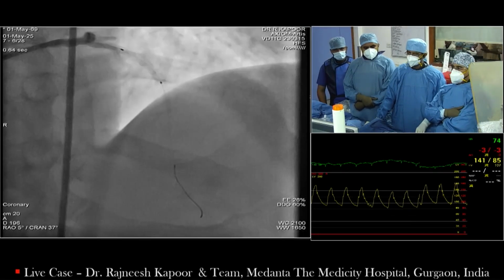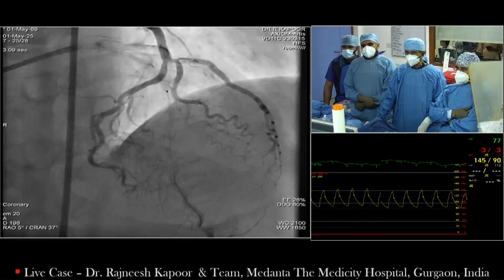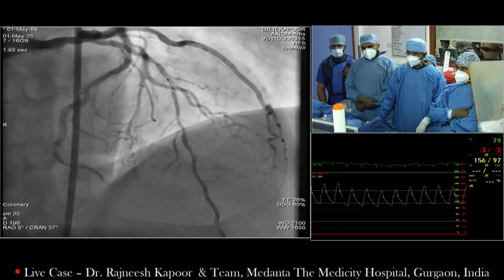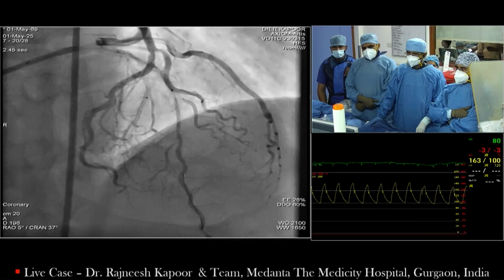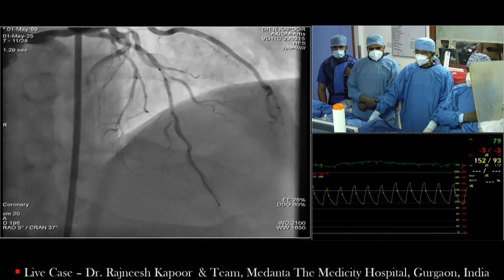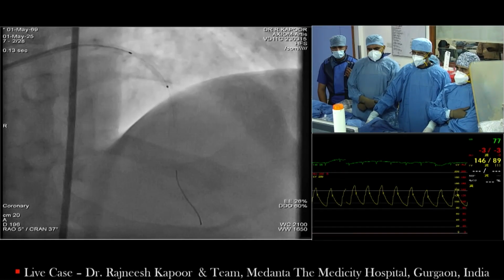All right, so casting my brain back to fellowship, I would definitely go with atherectomy first. So now from my underserved country perspective, we have none of these devices available. So if I do a cath like this and I see all of that calcium, I'm probably stopping at this point and referring for surgery. Because, you know, I could see that it's very, very heavily calcified. We do not have the devices available to modify that, and it can cause harm rather than any benefit.